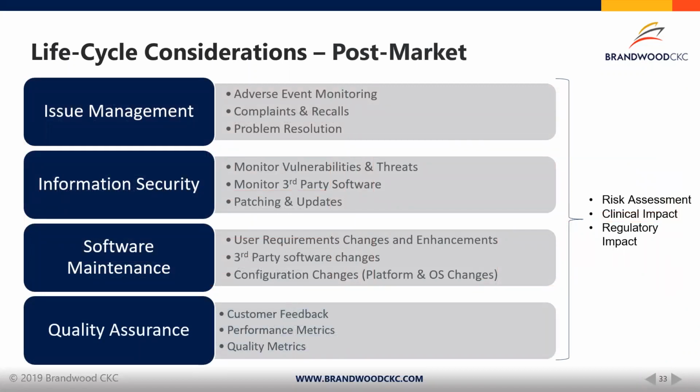Due to the nature of software, which is quick to develop and evolving, we thought best to spend a bit more time discussing the post-market surveillance or post-product release considerations. Due to the flexible nature of software, regulators expect the manufacturer to incorporate mechanisms within the software to collect post-market surveillance data for analysis. Here are 4 key post-market activities we want to focus on.